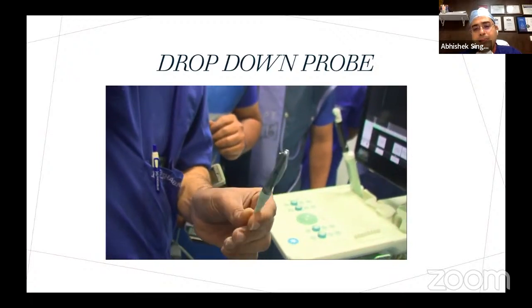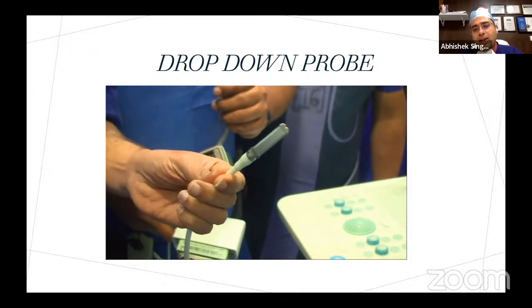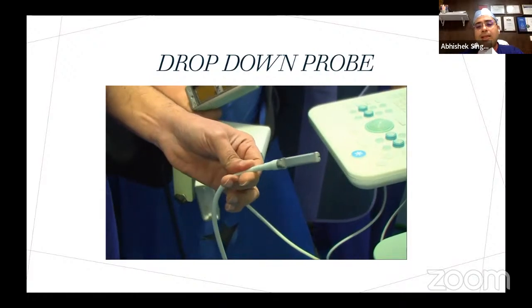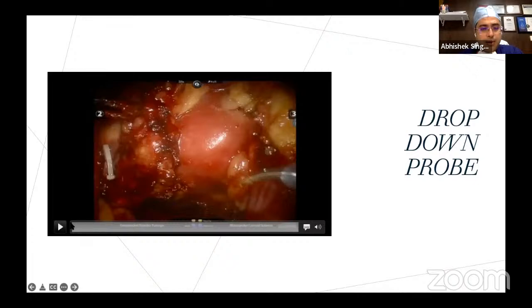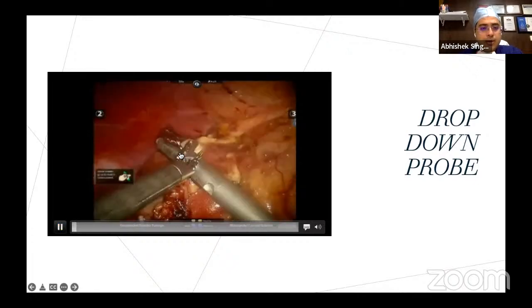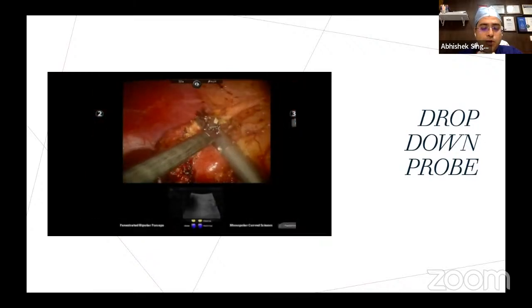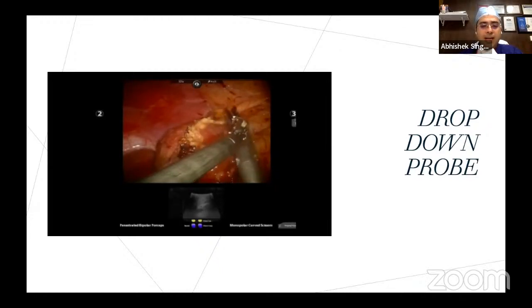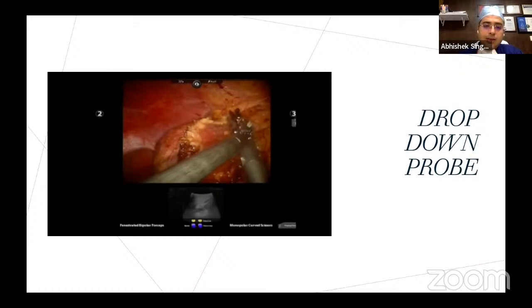The grip can be held by a robotic instrument. The distance markings can be seen along the length of the probe, and the tumor can be measured from all the sides. If you look at this particular example, this is the use of the probe. We are on to the tumor. The tumor is visible in a picture-in-picture format. We can keep marking the tumor throughout its circumference and then start cutting.